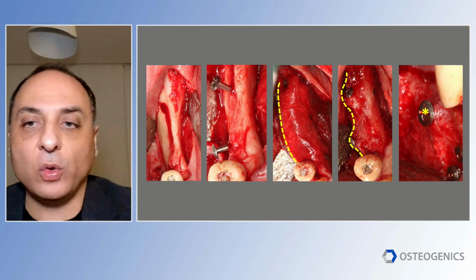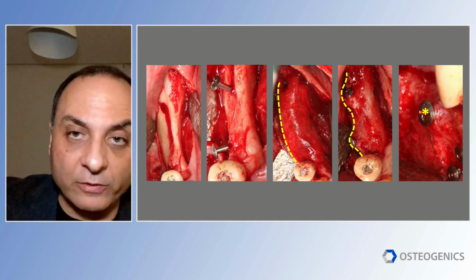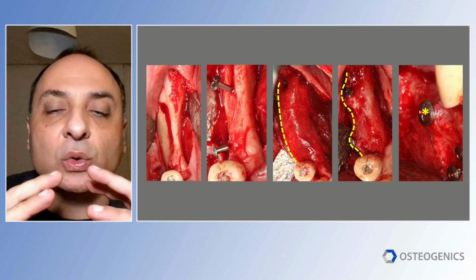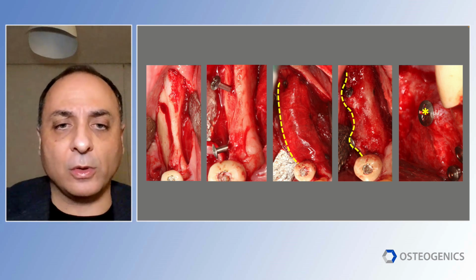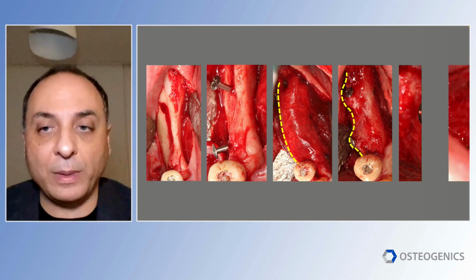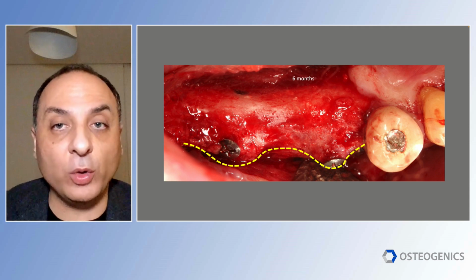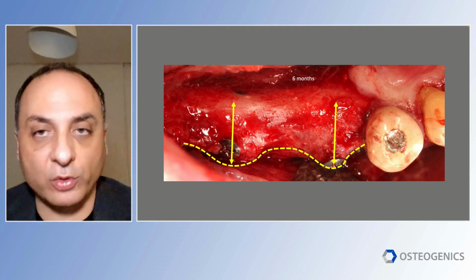And look at this sideway view. You see at the specific point where I have the tenting screw, I have this cone of bone, this volcano, this bulge of bone that is protruding outside the newly formed ridge and is coming around this tenting screw. So this is a very vivid example. Had I placed a third one, I would have had something better, but already the plan is to place only 2 implants. So you see, at the exact location of the tenting screws, I have maximized my bone gain. This is another proof that the tenting screws are an extra boost for the sausage.